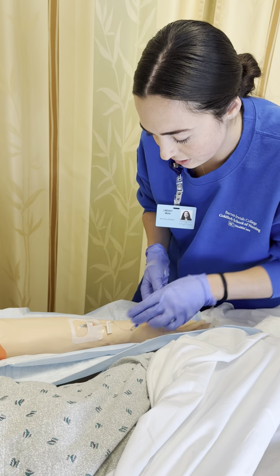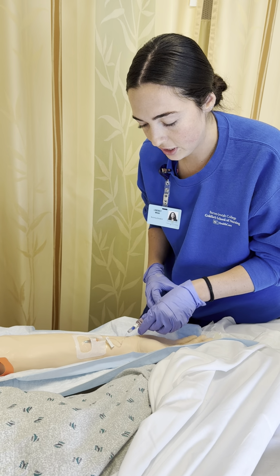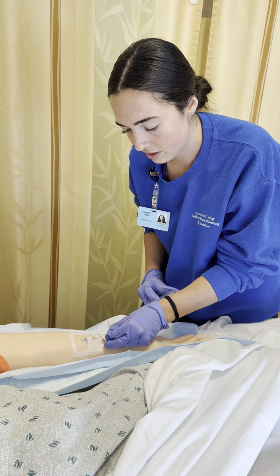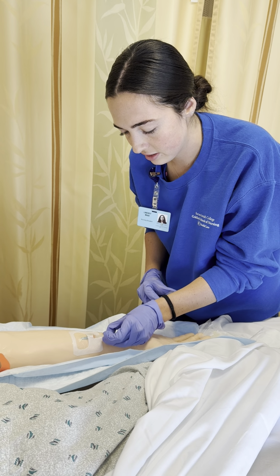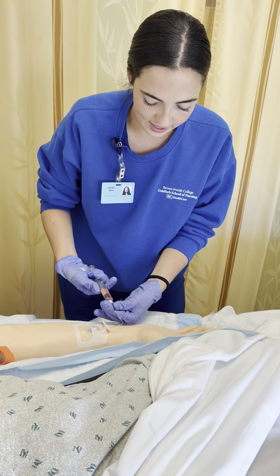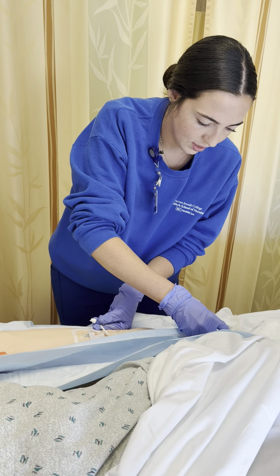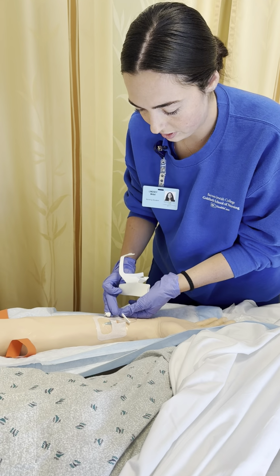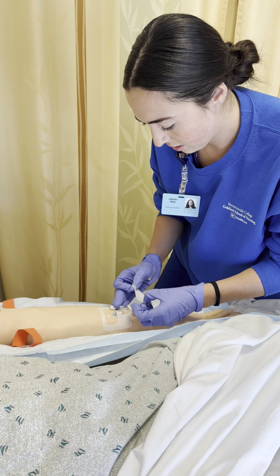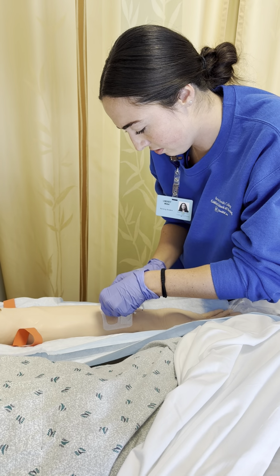Alright, so now that I've made sure that that's secured down and the IV's not going to go anywhere, I'm going to flush again, and this time I'm going to apply positive pressure to make sure to lock it in. So our IV is now locked. I'm going to go ahead and remove my flush. And I'm going to grab my piece of tape. I'm going to tape everything down.